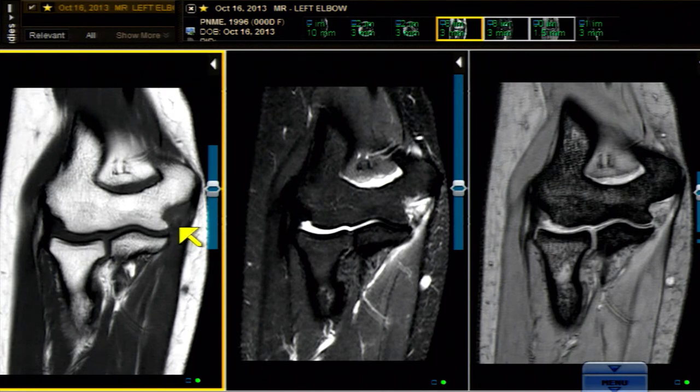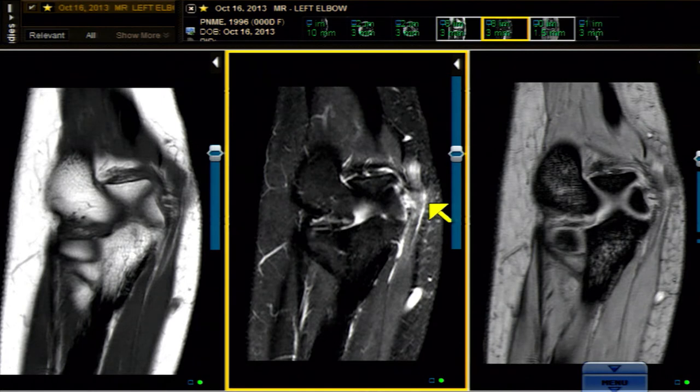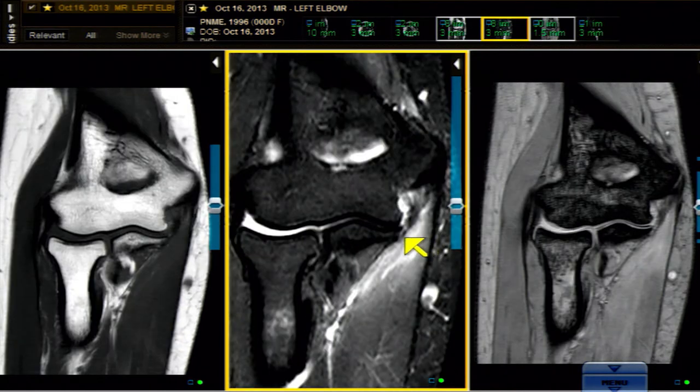On the very next cut it disappears, and on the next cut it still disappears. Where is our black band that should be sweeping tightly from the tip of the sublime tubercle and fanning out more proximally? It's ruptured — at this locus, which is slightly to the back of the anterior bundle. The entire proximal origin is off. There's dissecting blood into the UCL all the way to the tip. That bright signal approaching the sublime tubercle is abnormal.